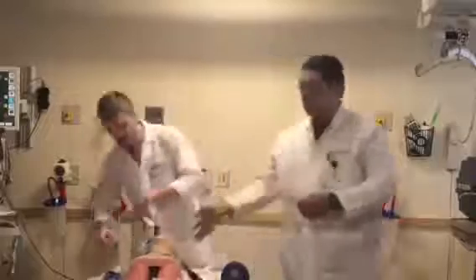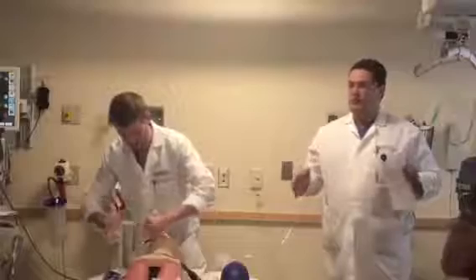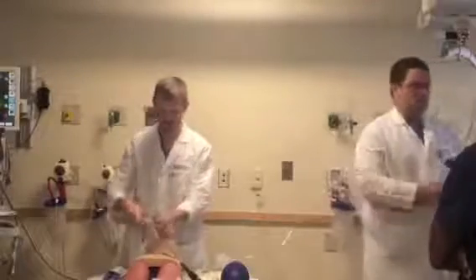All right, and then we'll inflate 100 cc's and 20 cc's in there. So we're done with the airway algorithm. I just want to show you a couple of things, just for fun.